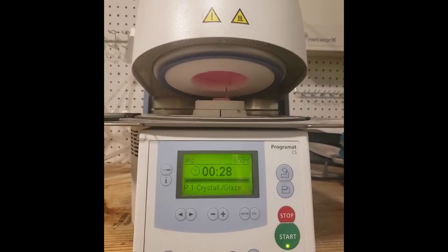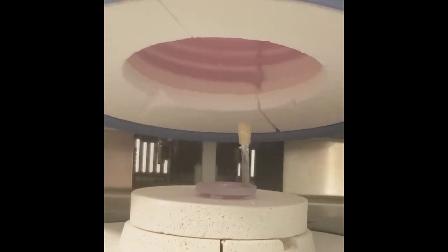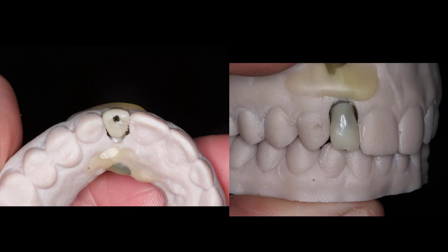I have a VHF Z4 mill and I'll use that to mill the crown I just designed. It's been milled — the fit was great; it was in emax, so this is it coming out of the firing oven, and it just needs to be bonded onto the tie base. Here you see the final milled crown bonded to the tie base — a screw-retained restoration on an angled tie base. The 20-degree angle tie base corrected what was originally going almost through the gingival third of the tooth. The doctor just needs to orient the flat of the driver to the spot on the guide, and the restoration will seat perfectly and be ready for the final restoration as well.